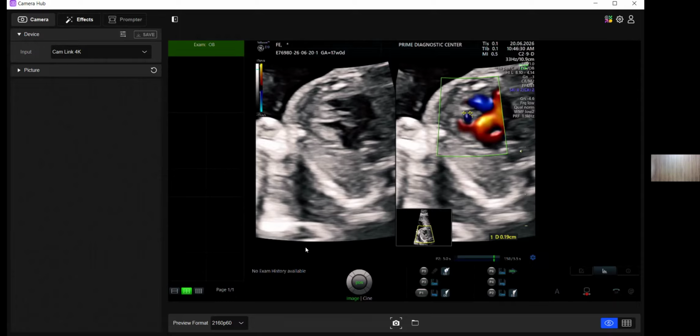Sir, if our appearance is changing depending on the fetal head position, should it not also change in the oblique position depending on whether the head is below or above the umbilicus? I think further than that, go back and try. It won't. I can say that much now.